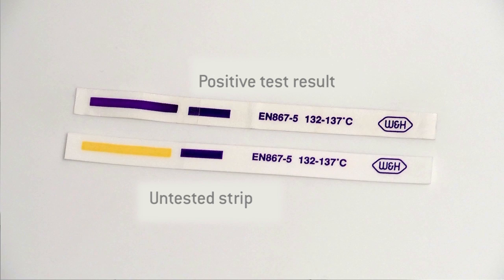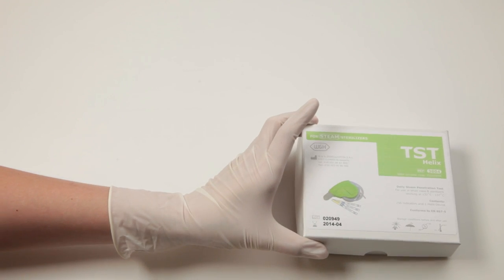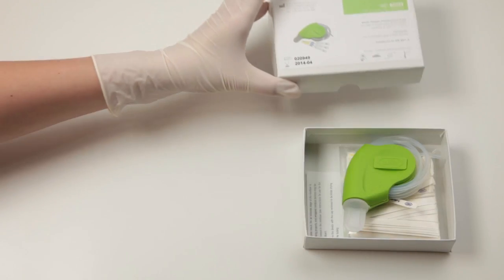A positive test result must show that sufficient air has been removed during the sterilization cycle. A Helix test cycle should be one of the first cycles carried out before the sterilizer is used in normal operation.